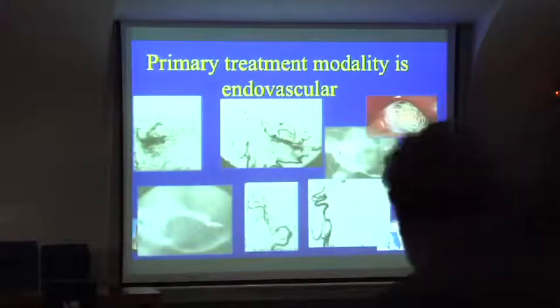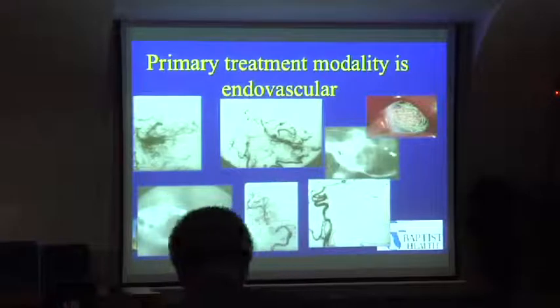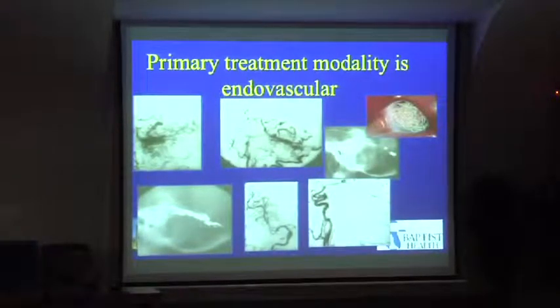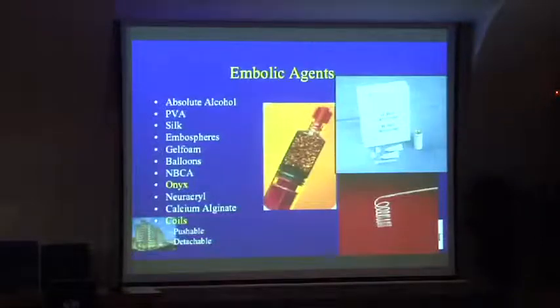Prime modality is endovascular. There's no discussion. When in AVM, especially after ARUBA, endovascular took a big hit. In dural AV fistulas, there's no question. This is an endovascular problem, and you go for a different approach if you cannot treat with endovascular.